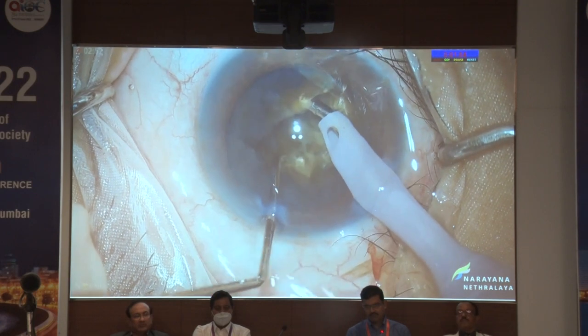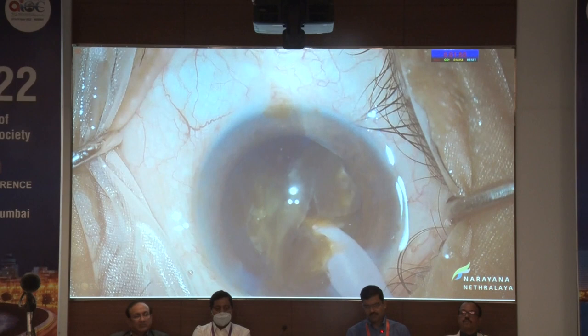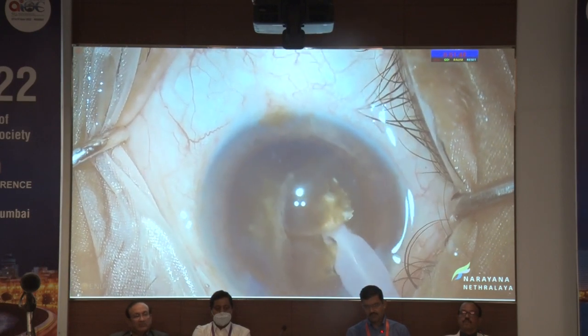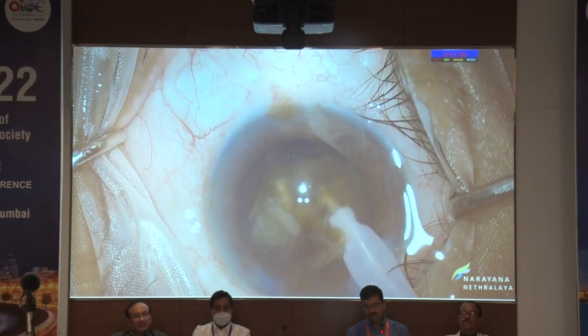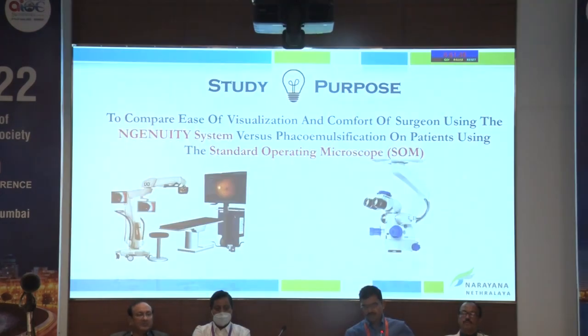So here's a black cataract. Even doing a surgery on a black cataract is extremely easy. The key point is, whenever you're doing quadrant removal, always place the phaco tip in the center. Do not shake it when you're pressing step 3. And I always remove my second instrument so that it creates better fluidics within the eye.